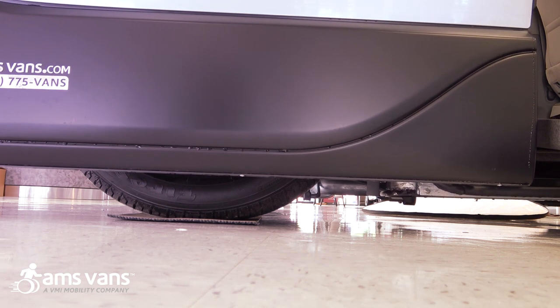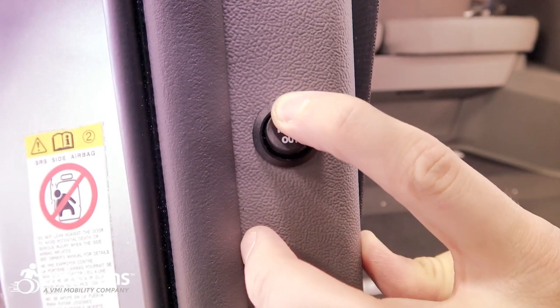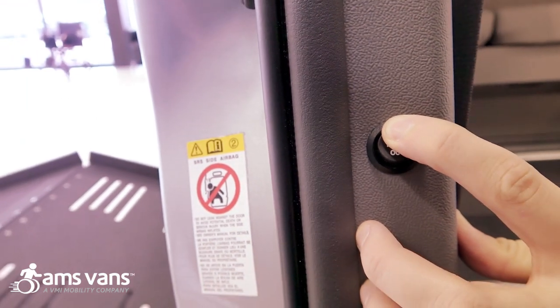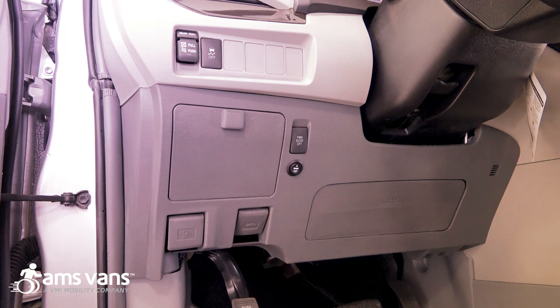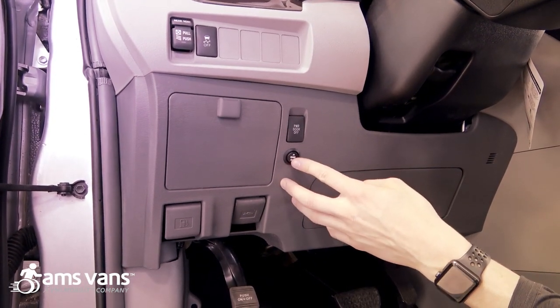In addition to the ramp remote we also have another area to deploy the ramp. We're going to bring the ramp in here just by holding the button down — this is also going to raise up the kneeling. For the third option to deploy and stow the ramp, you have another button right here on the left side of the steering wheel.